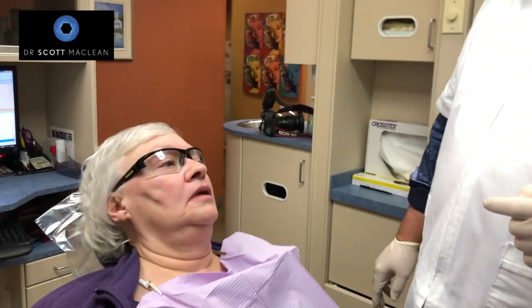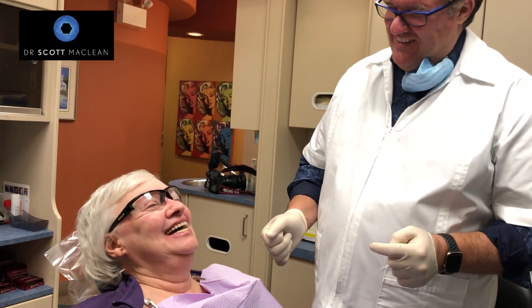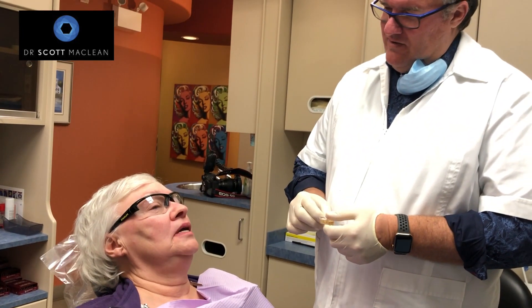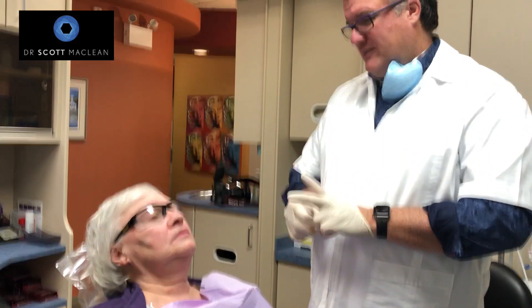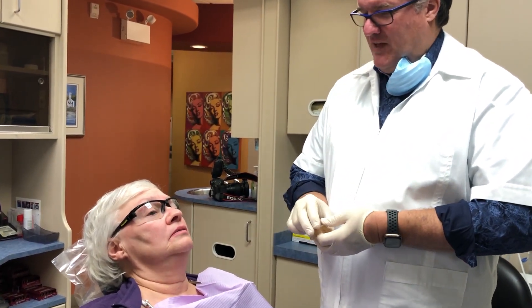She's doing fantastic. Any other things you'd say to someone about this type of process? You get it. You look fantastic with it. My smile's better. My talking is better. My eating is better. They're just like my normal teeth. Thanks for saying that, Winnie. That's why we practice dentistry — to hear that. Just like my normal teeth. Thanks so much.